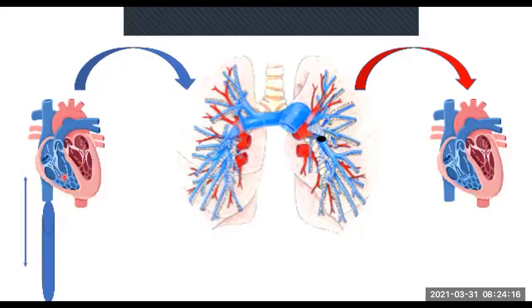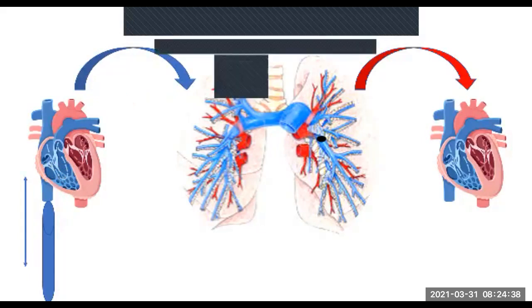So what do you think is going to happen to that right ventricle? Remember, this is an acute thing. The body doesn't have time to adjust and compensate. Does it get bigger or smaller? Bigger, very good. So let's draw that in there.